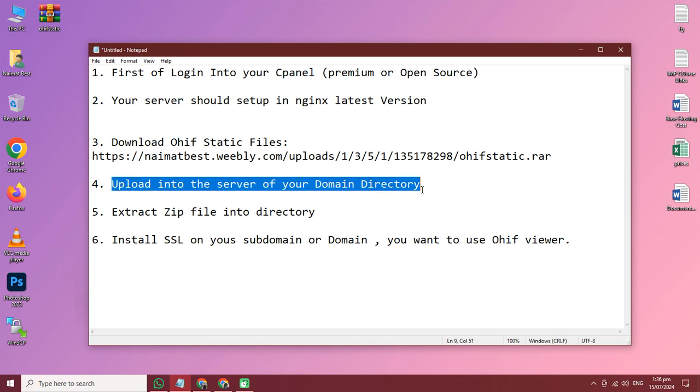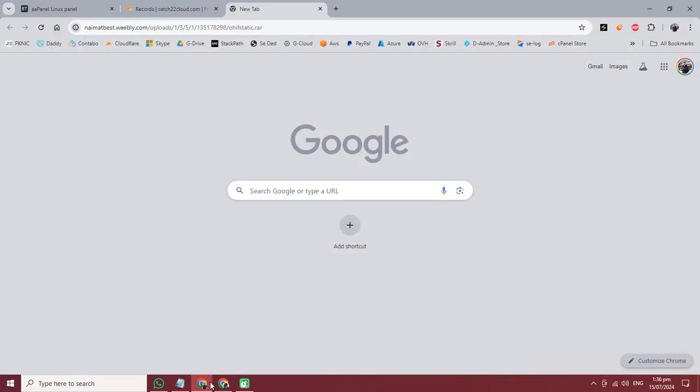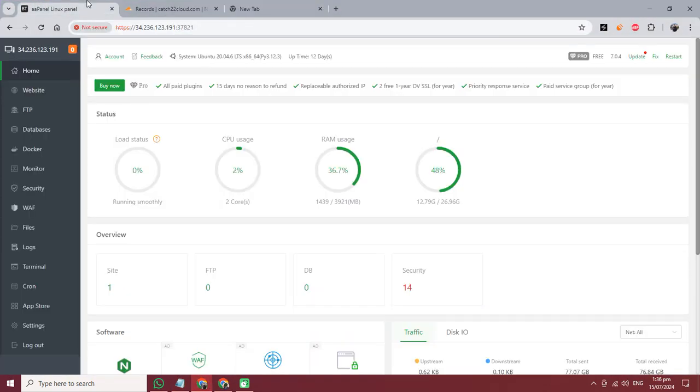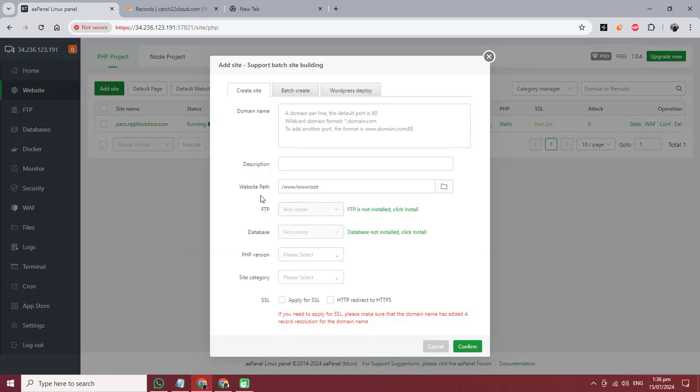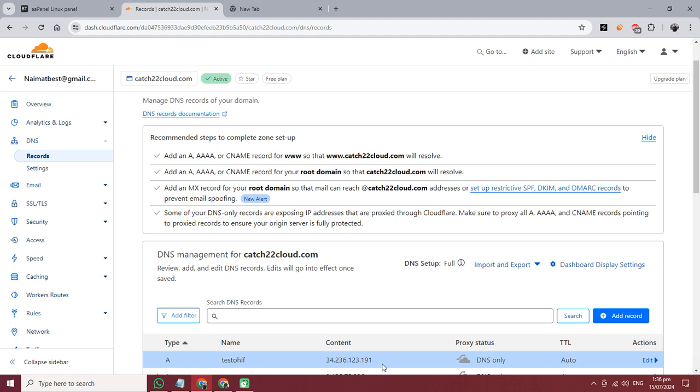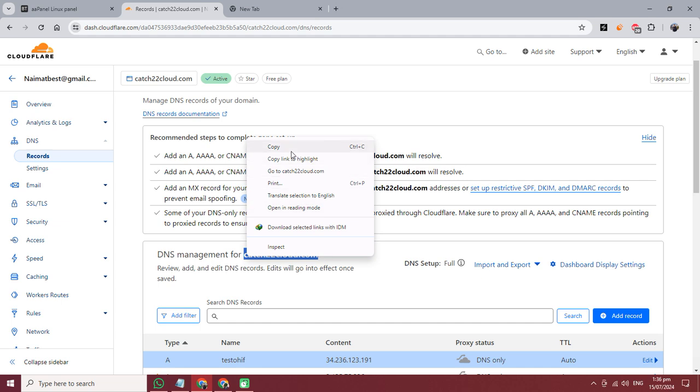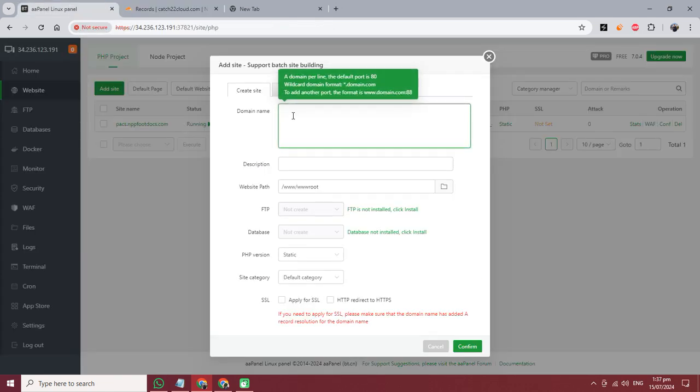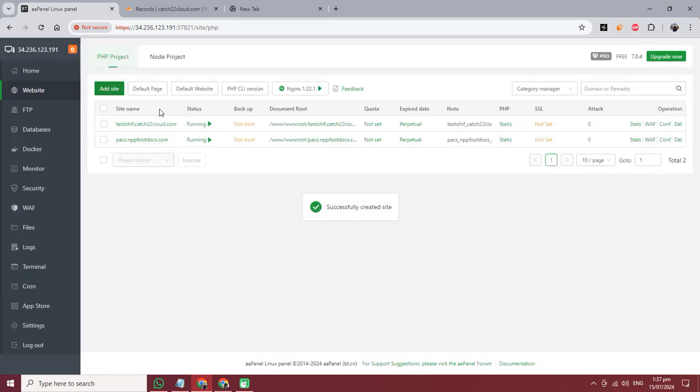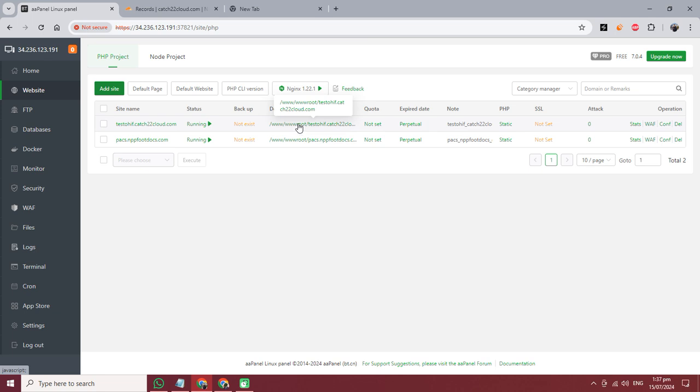Upload into the server of your domain directory. Now I am creating the domain or using a subdomain - you can use whatever you want. I have already created the domain test.ohif and pointed it to the server IP address: test.ohif.cachedentitycloud.com. It's confirmed, it's created. Now I am going to the root directory of my domain.